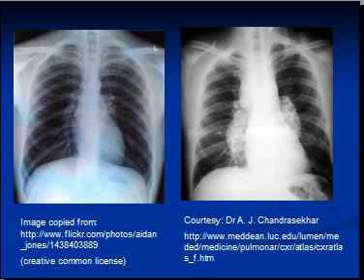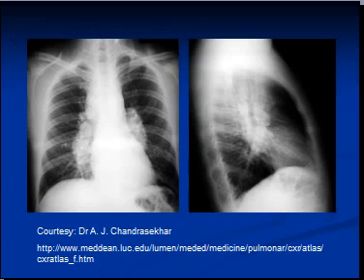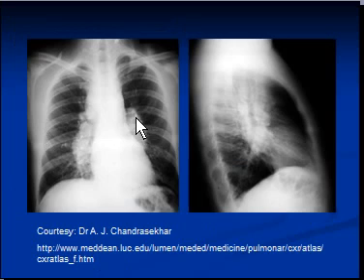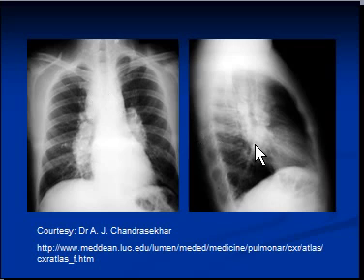Looking at another set of chest X-rays, the X-ray on the left hand side shows bilateral hilar lymphadenopathy and enlarged paratracheal lymph nodes. On the lateral view, this shows up as a hilar mass.